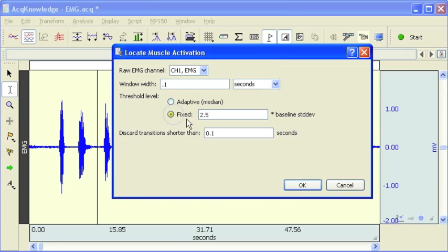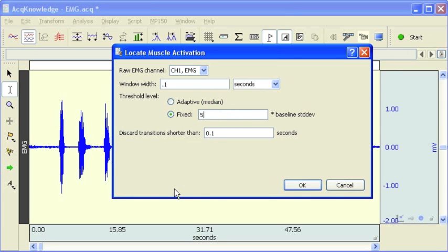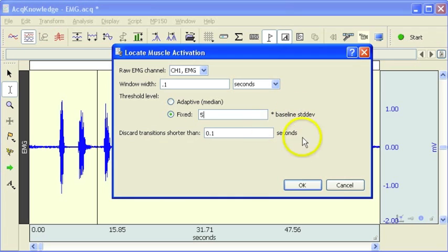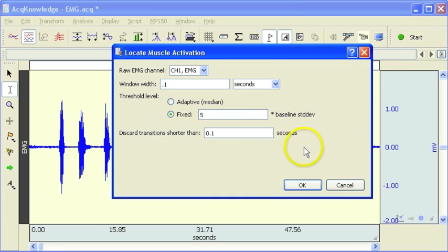I'll leave my envelope set to 100 milliseconds. This time, however, I'm going to use a fixed threshold. I'm going to set this to five times the baseline standard deviation. Now I'm going to hit OK.